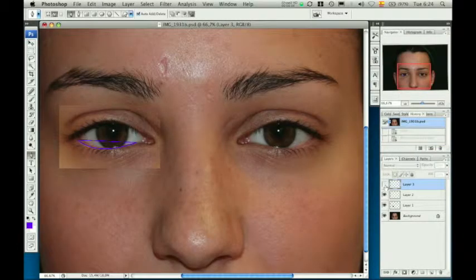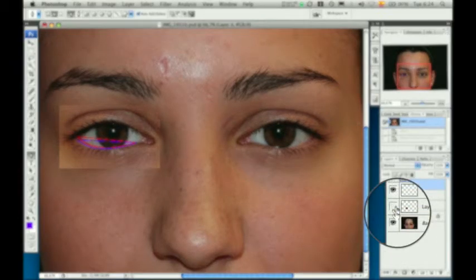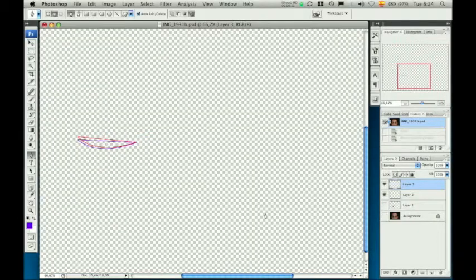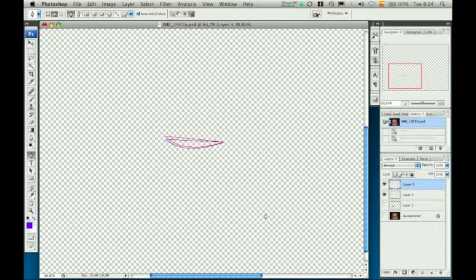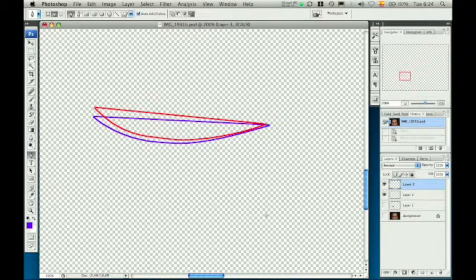We end up with four layers: two outlines and two images. By toggling off the view icon of the image layers, we can visualize the resulting diagram, which illustrates both eyelid outlines — the left in red and the right in blue.